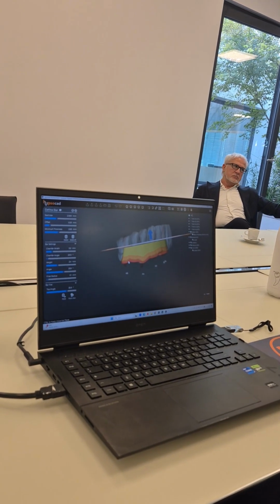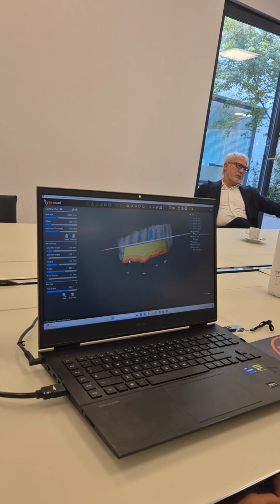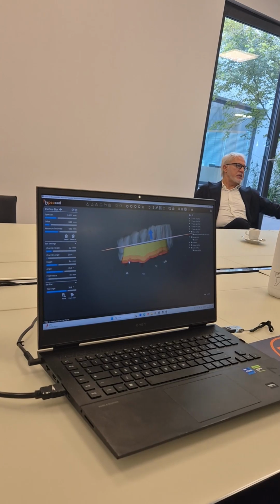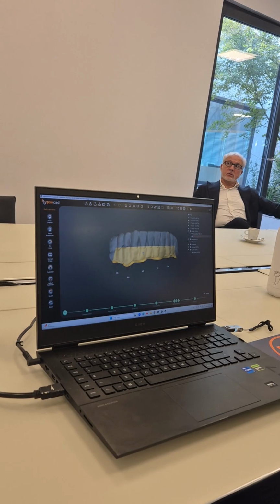And I imagine that you made some tests internally to have the perfect check. Yeah, sure. This is exactly our job, to check every day if it works. Because this is a big pain for dental technicians. We know that.